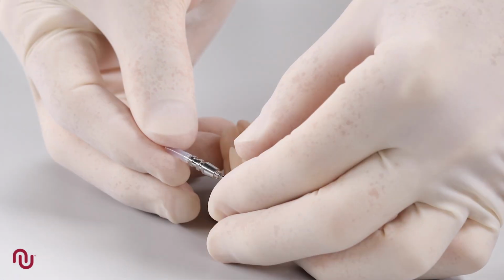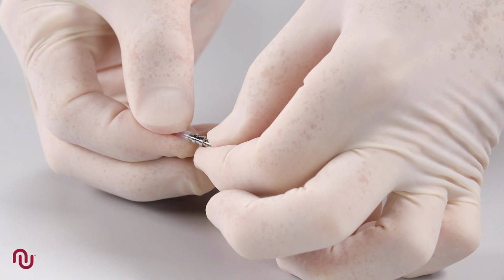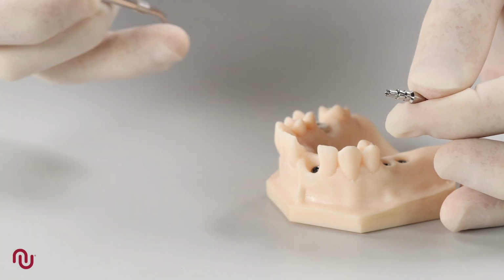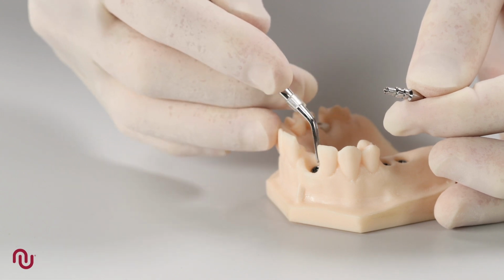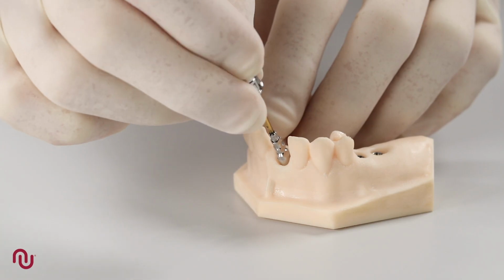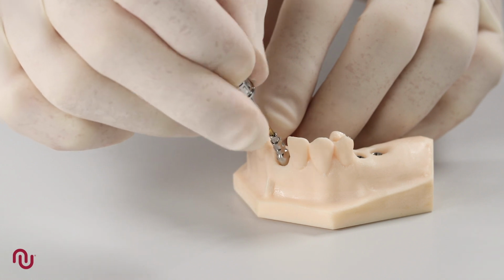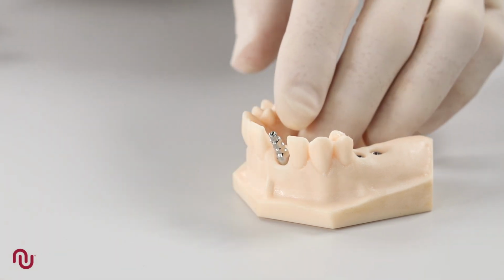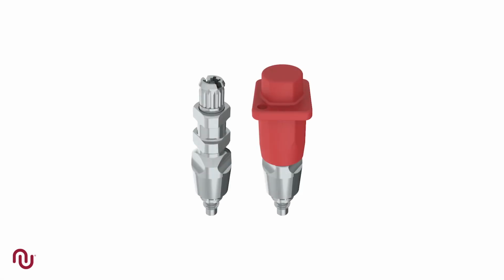First, the plastic extension sleeve on the impression coping screw is removed. The implant connection is exposed, and we make sure that the top of the implant is clear of any soft or hard tissue. Place the desired length impression coping onto the implant and tighten the screw with the screwdriver and manual handle. The upper part of the impression coping has a direction indicator located between the 2 flat surfaces that will enable the red cap to orientate buccolingually.